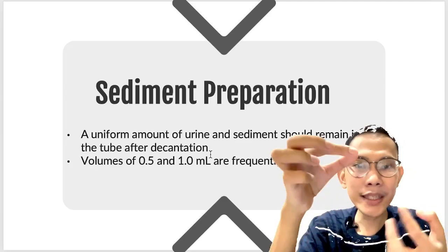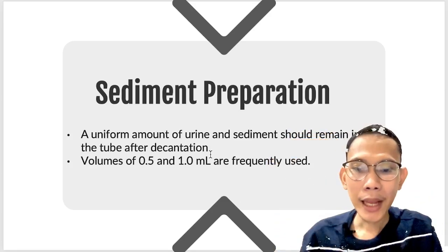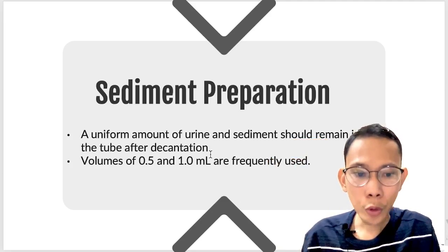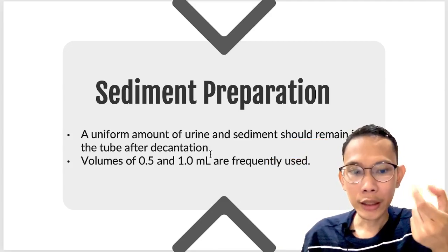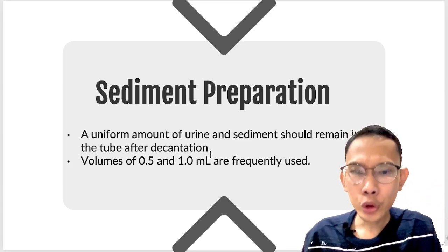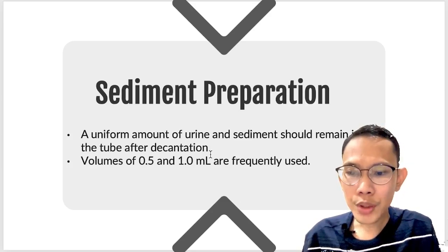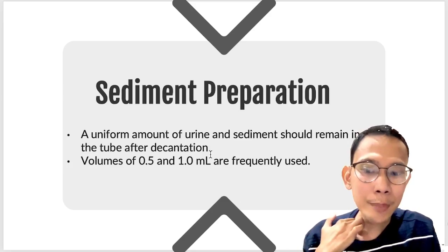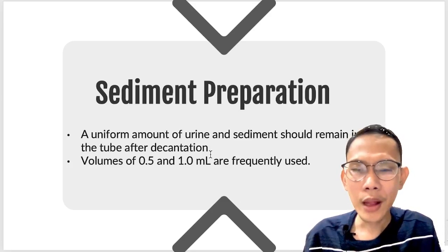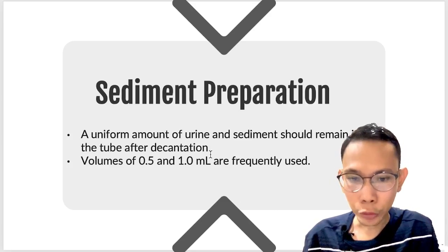So, you can flicker. Ito yung sinasabi ko na dapat i-flicker natin, resuspend natin. This can be done by a commercial system or by the tips of your finger, if you flicker lang natin, or by tapping the tip of your tube. And then, you do not do a vigorous agitation because it will disrupt some cellular elements. So, nadi-disrupt yung other elements, so nadi-destroy sila. Therefore, we will not be able to get an accurate reading later on.